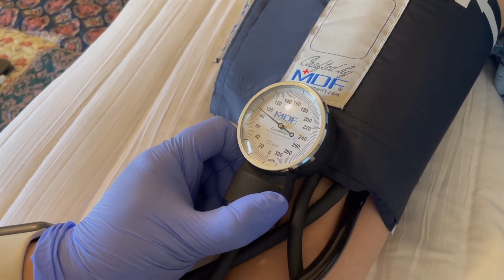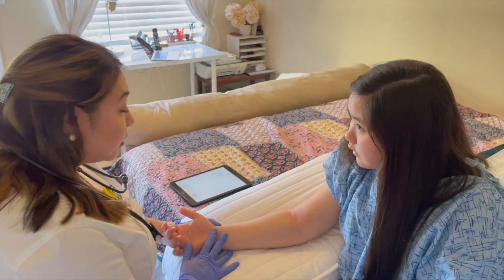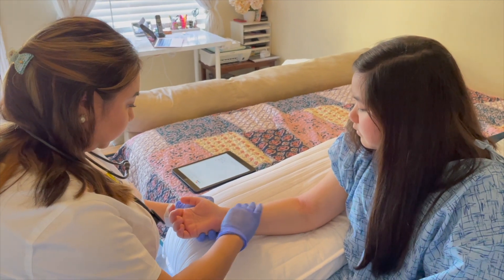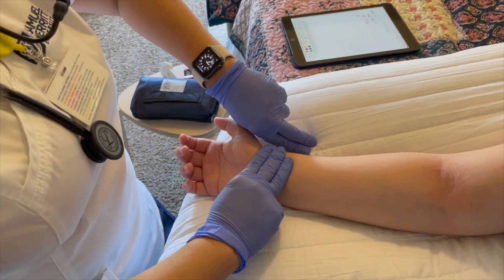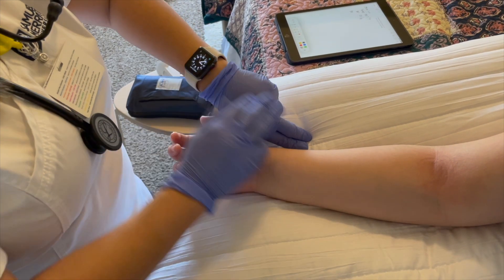Don't forget to document the results. Next, I'll be assessing your radial pulse. Correctly locate and palpate the site, using the fingers and not the thumb when palpating. Count for 60 seconds, note the rate, rhythm, and quality, and document the results.